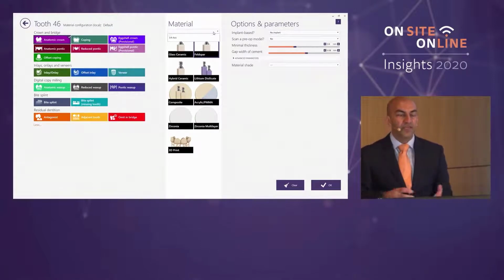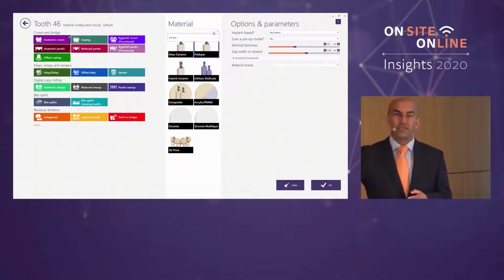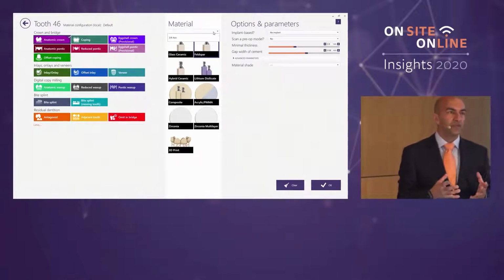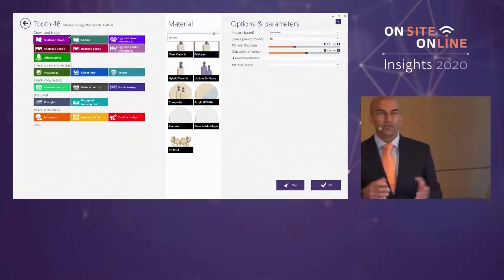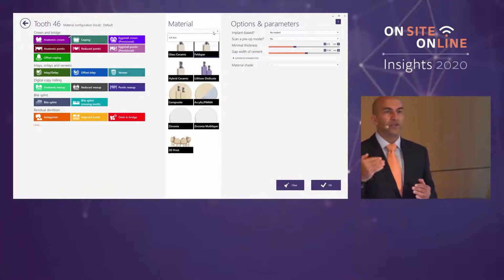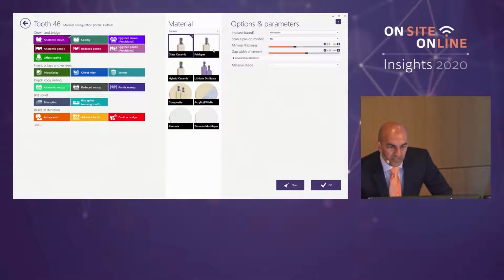Over in the middle here, this software version of chairside CAD is specifically linked to the VHF Z4. So depending on what machine you intend to buy, and the software does link to several different machines, you would tell your reseller, that's what I want, and then they would provide you with the software that matches with that. So the VHF Z4 is a 4-axis machine.